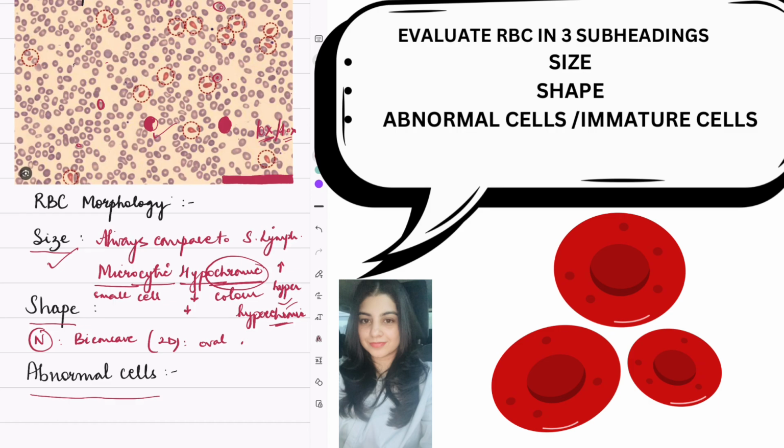In this, as you can see, these are teardrops, as if tears are coming out of the eyes. So these teardrops you have to mention. Teardrop cells are observed predominantly. This is how you will report it. Okay, predominantly, as you can see, teardrop.